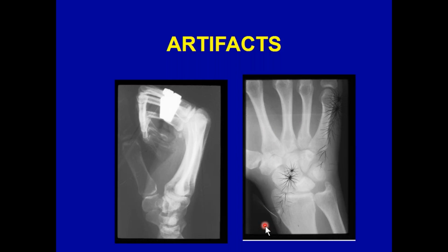But in spite of all those suggestions and hints, this is an example of a ring artifact. Now you can argue the patient couldn't get the ring off. The better question is, did you make the attempt? Can you give them a little bit of lotion? Does it slide off?